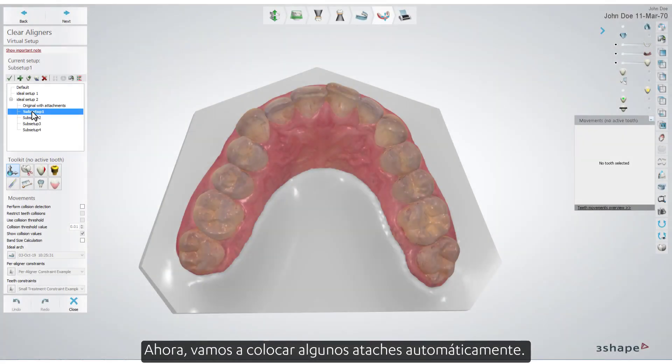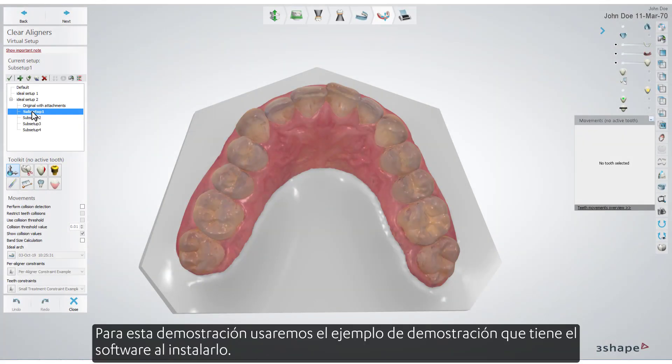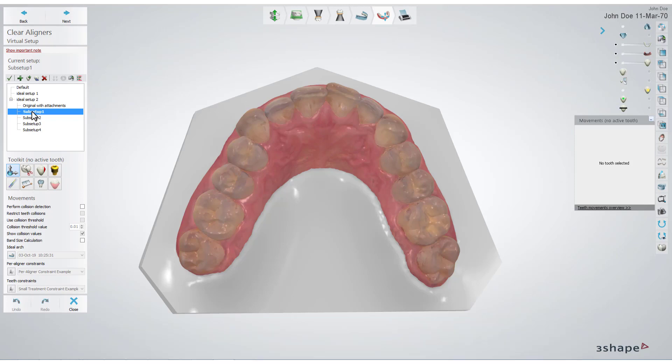Now, let's place some attachments automatically. For this demonstration, we will use the demo example that the software has when you install it. Move some teeth and then go to the aligner where you want the attachments to appear for the first time. Click the Attachments button.